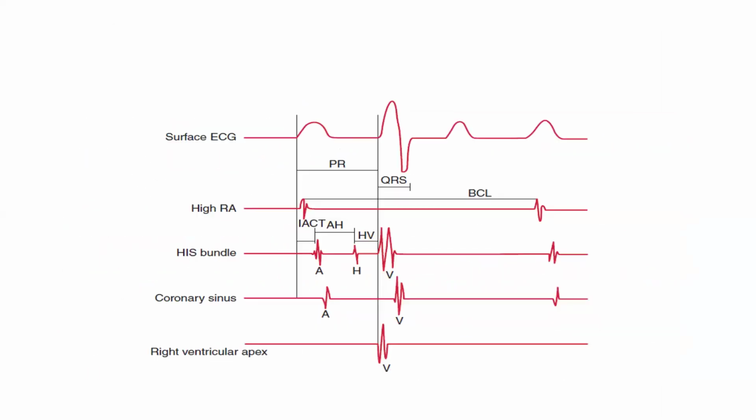Okay, so we'll soon be rounding up. I just want us to quickly see some things here. We've understood well these conduction intervals. The next is to also understand the basic cycle length on EGM.